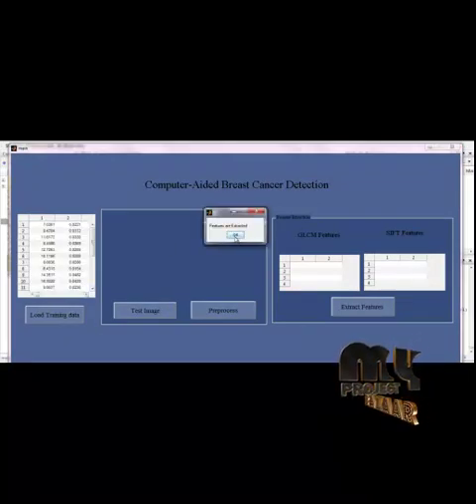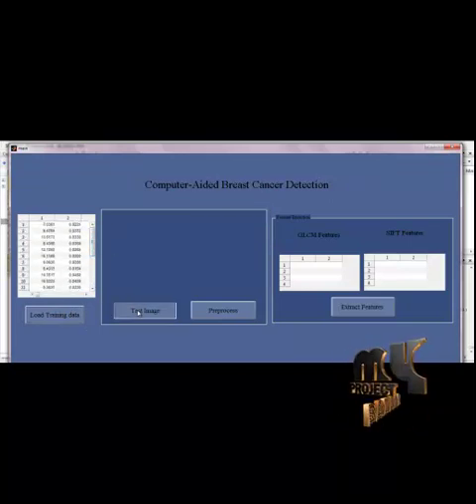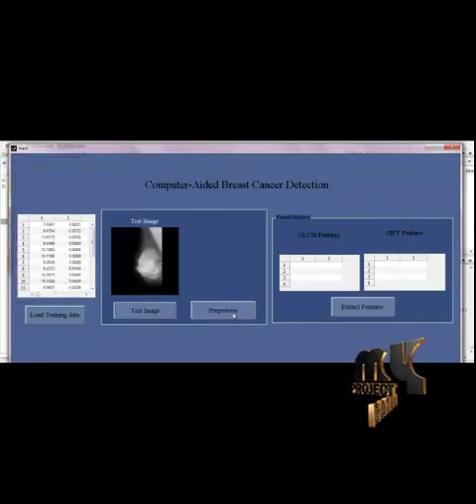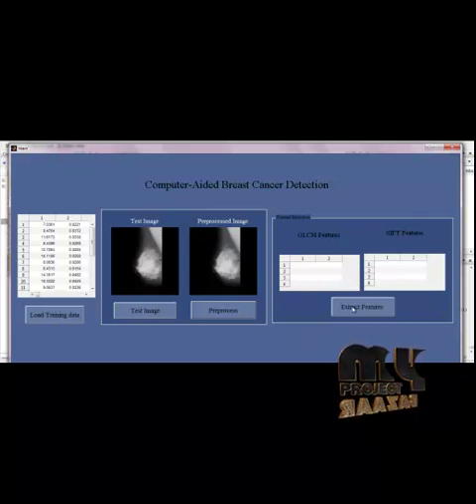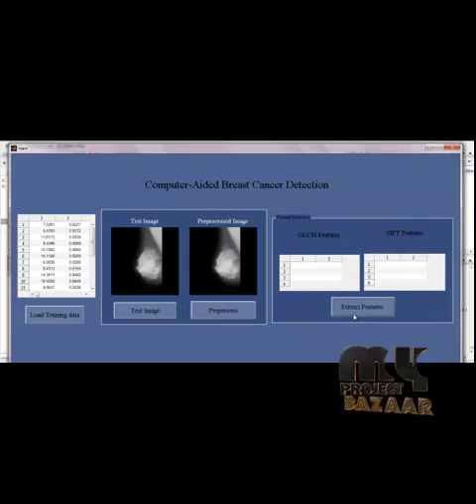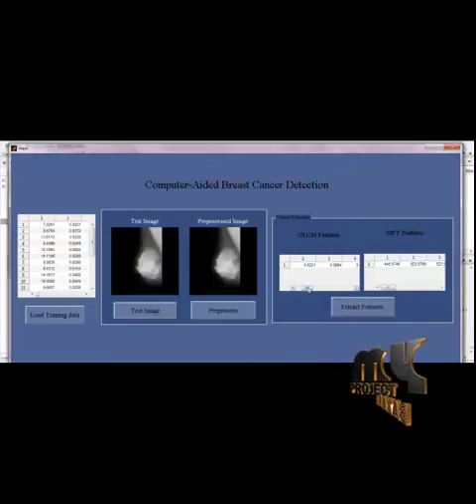When you click on the Load Training Data button, features are extracted for all the training images and saved. Then, when you provide a test image as input, the image is displayed. When you click on Pre-Processing, the median filter is applied and the result is displayed. When you click on the Extract Features button, the GLCM and shape features are extracted from the mammogram image. The feature values are displayed in a table format and saved.